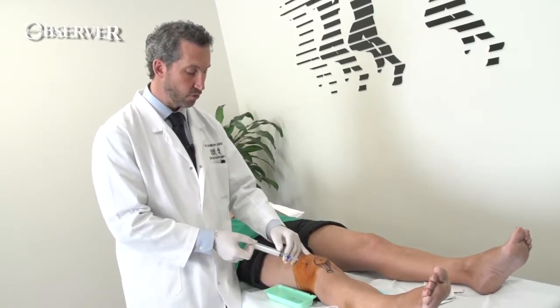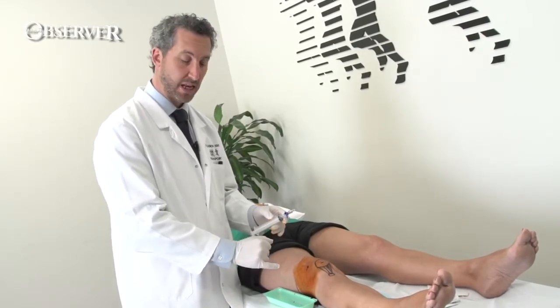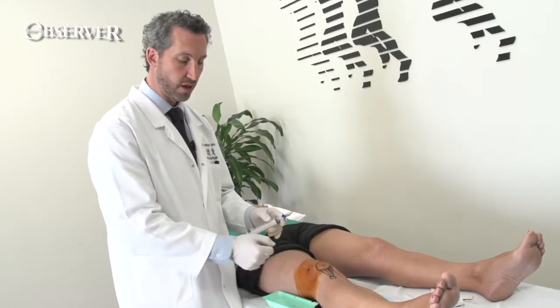Warn the patient that there's going to be a sharp sting. If you're worried about the patient's pain level, you can inject a small amount of lignocaine into the skin or use a freezing spray.